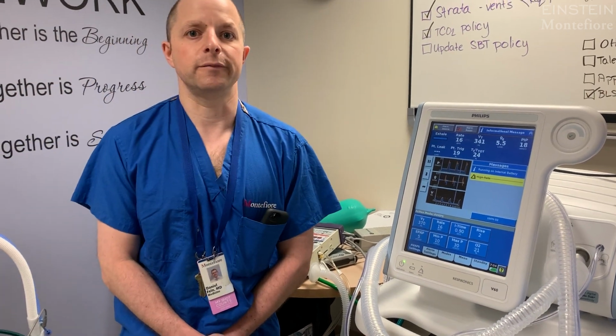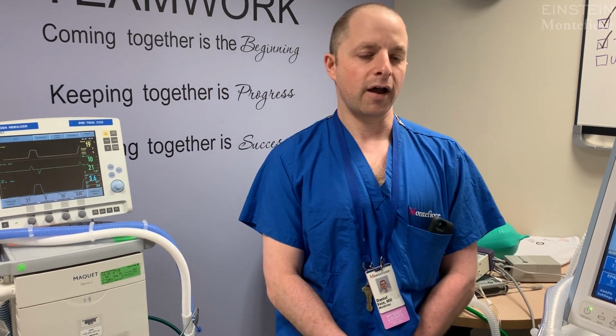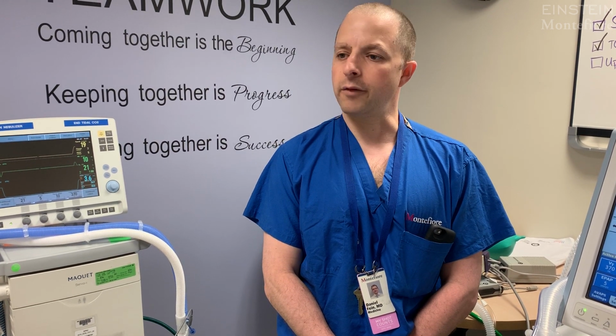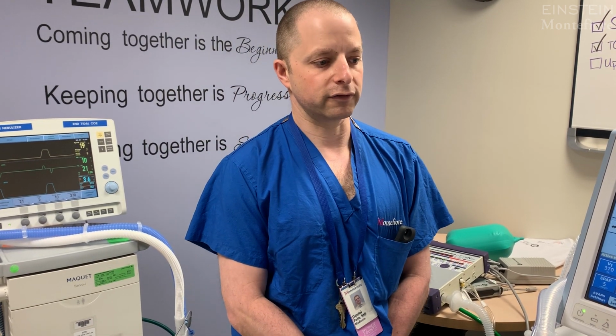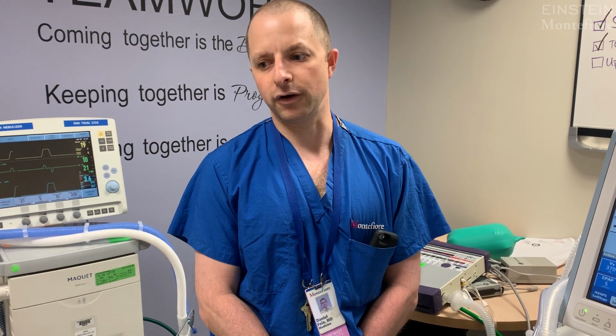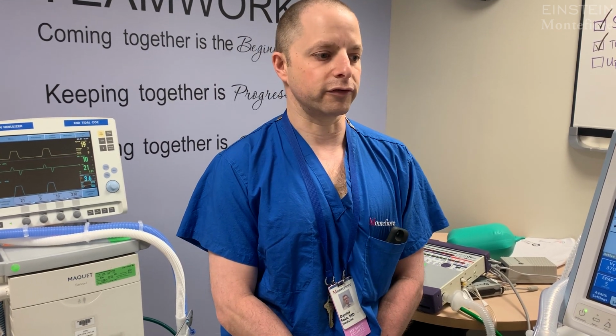So, when a patient becomes unstable on a ventilator, there are several things that can be going on. One of them is that the patient's primary reason for their illness has become worse. So maybe their ARDS has progressed, or they developed shock in the setting of either COVID pneumonia or any other process going on. And then the other things that could be happening are a problem with the equipment itself. So there's something called the DOPES mnemonic that you can go through to figure out what exactly is going on and help you troubleshoot the patient.